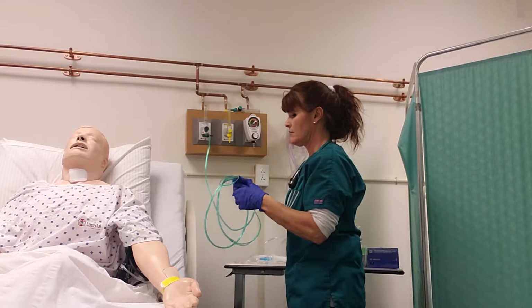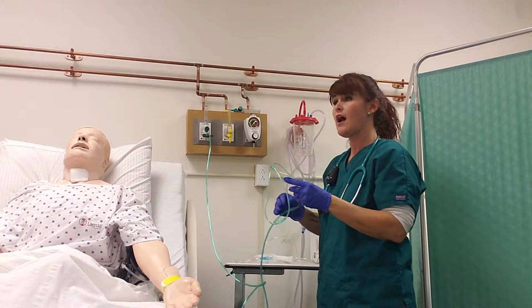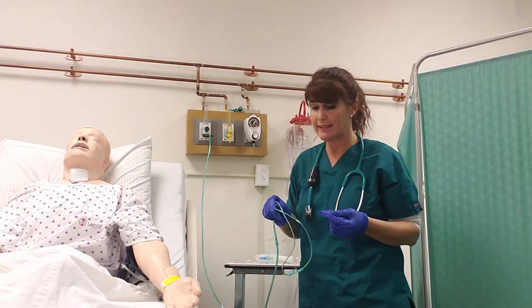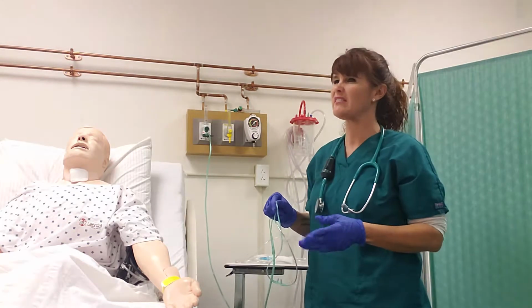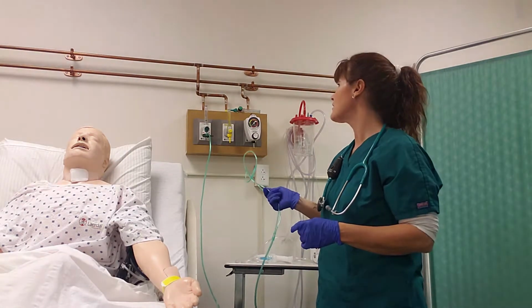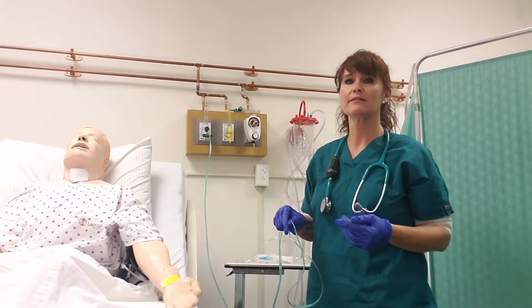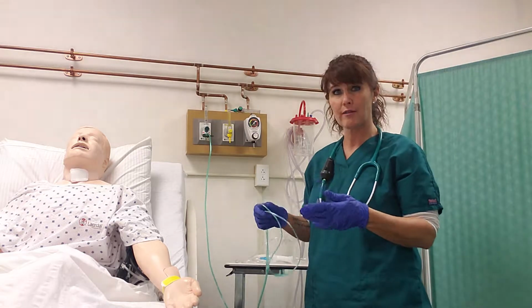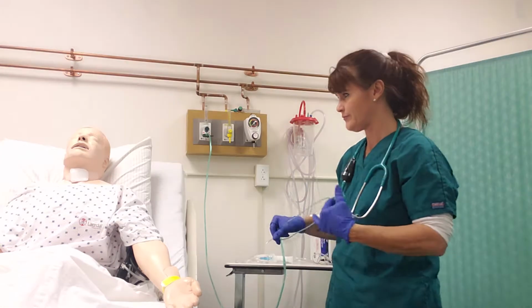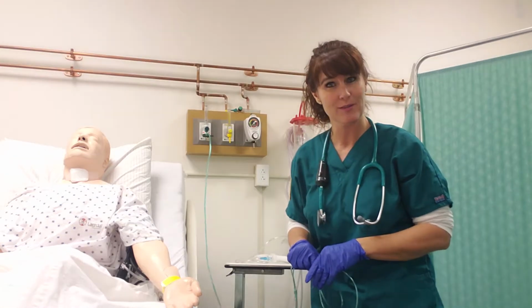Okay. All right, so I have this set at a 2 liter a minute flow. Again, the patient has COPD. We only need to get his oxygen up, per the doctor's orders, about 2%. So I chose to go with a 2 liter flow. We're gonna check in about 20 minutes and make sure that, if things are going up, the patient's getting good flow. The patient's SpO2 is improving.